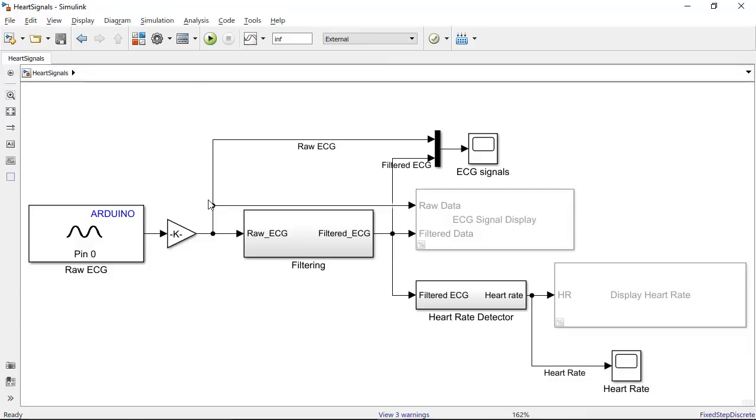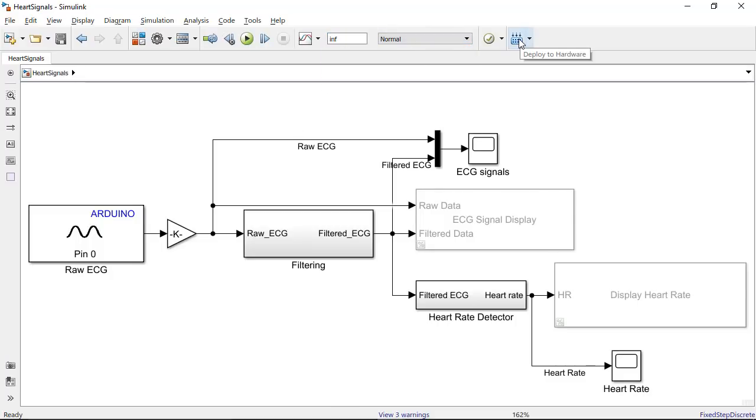Once you have tested your algorithm, you can then use normal mode and deploy this code to an Arduino. What I mean by that is you can make your Arduino function independent of Simulink and the PC that it was connected to.